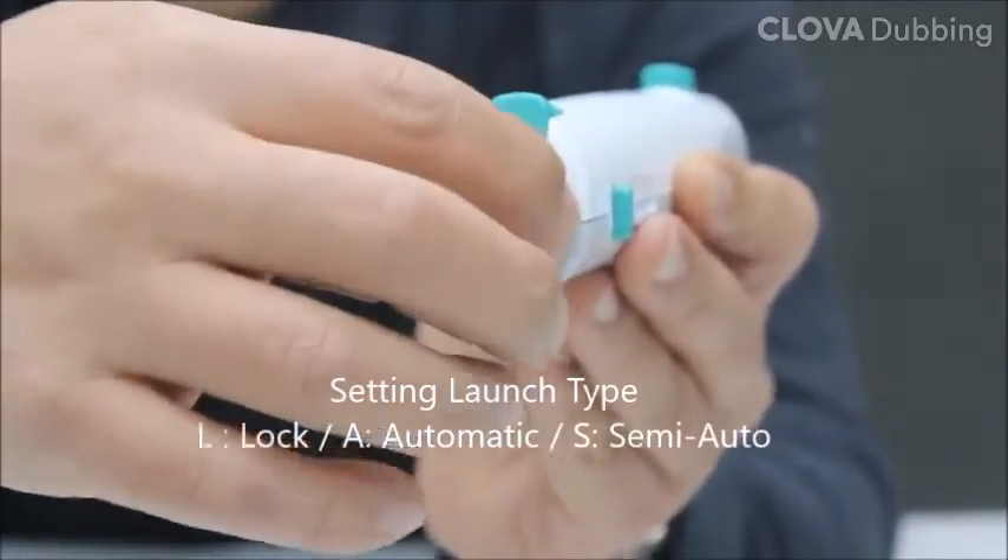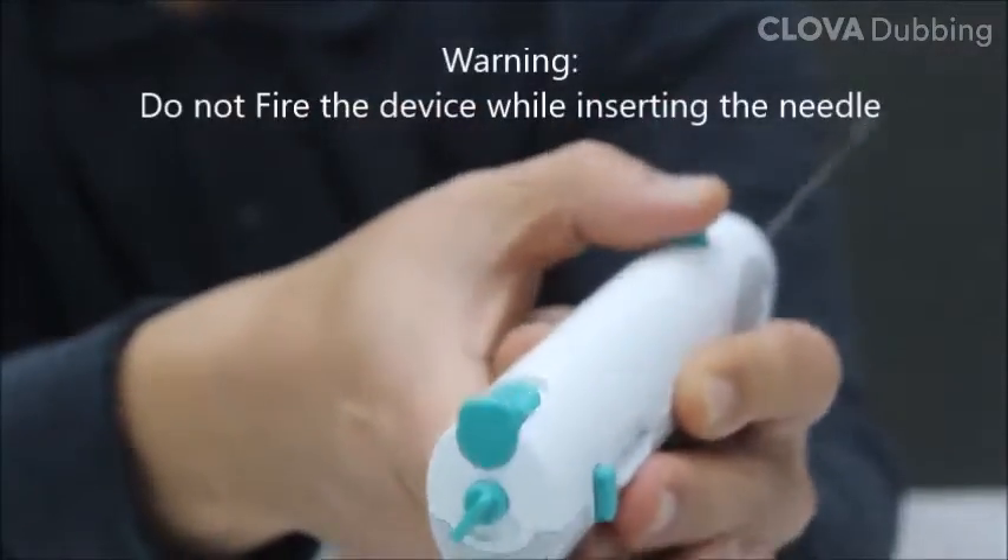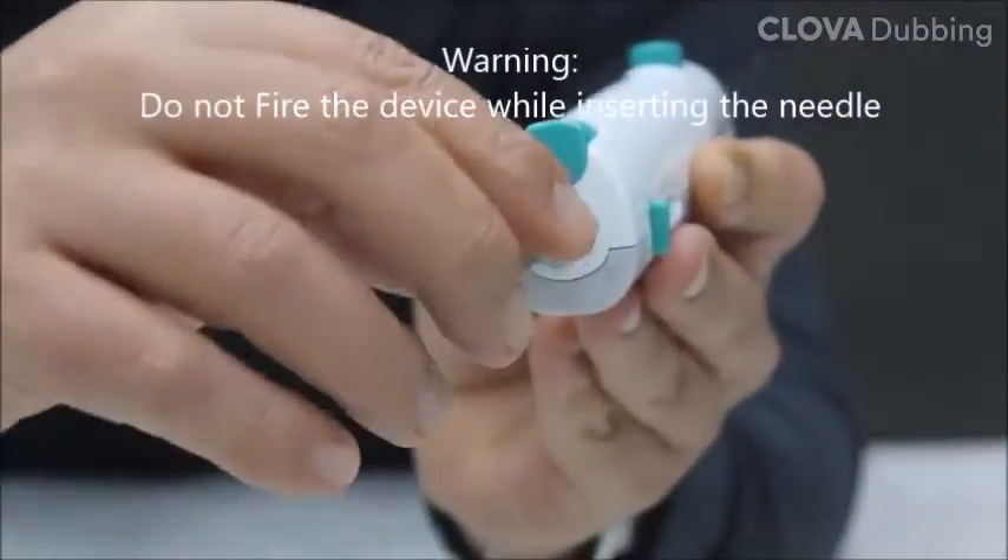It is recommended that the launch type be set to L to prevent accidents caused by mistakes. Do not fire the device while inserting the needle.